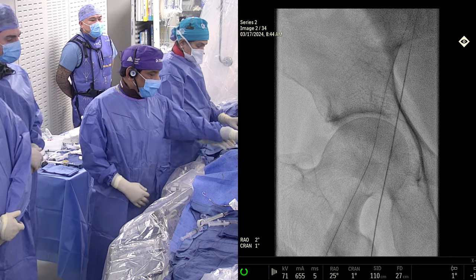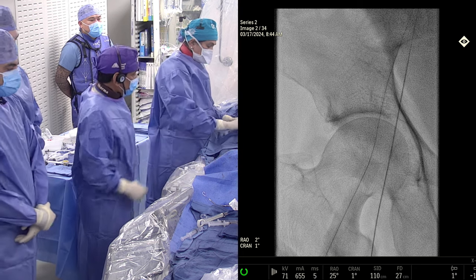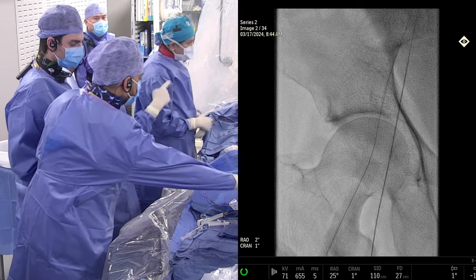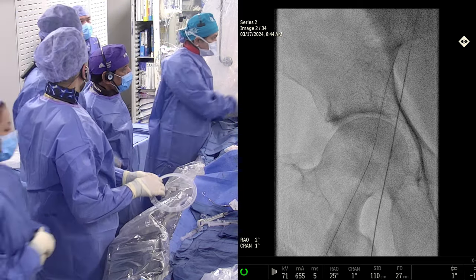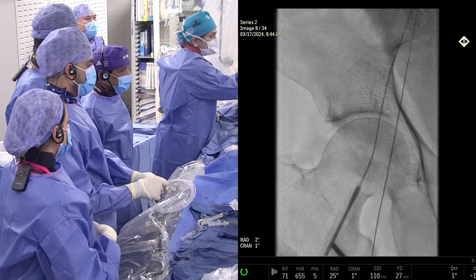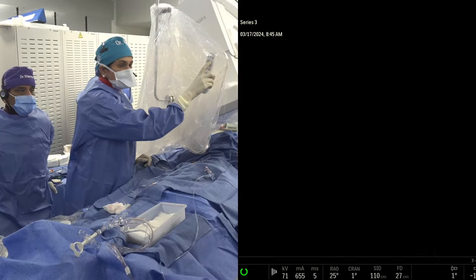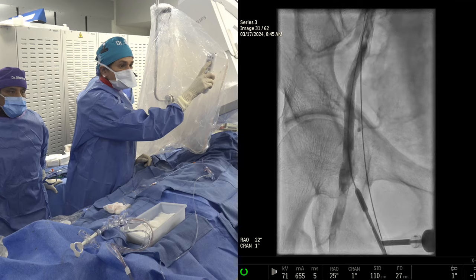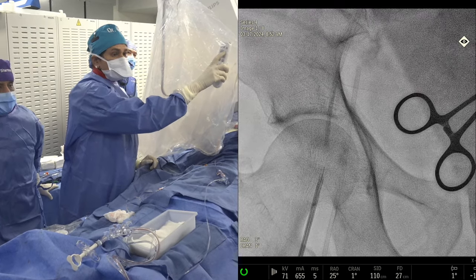We'll do the Impella insertion live — we already have a pigtail there. The groin, as you can see, had pre-close done by Manish. We have the Impella sheath already inserted — two pre-closes.